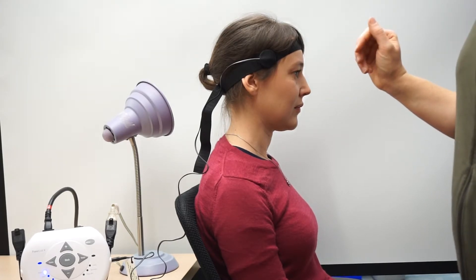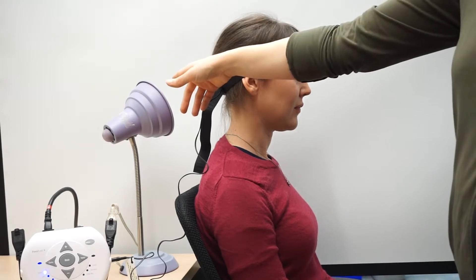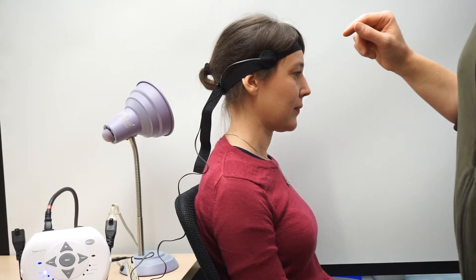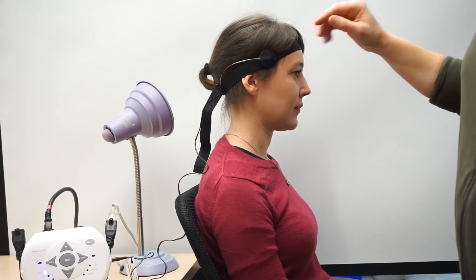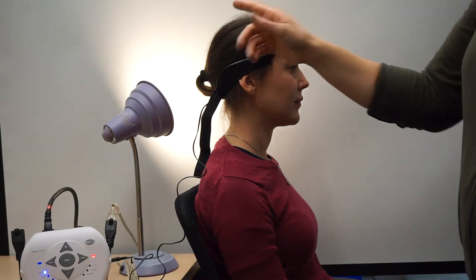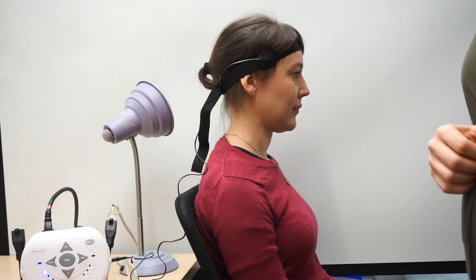This switch is plugged into a power link that will activate this lamp on direct mode, which means it will be activated the whole time that the user has her head tilted. So if she tilts back, the switch is activated and the light is on. If she tilts back forward, the light turns off.